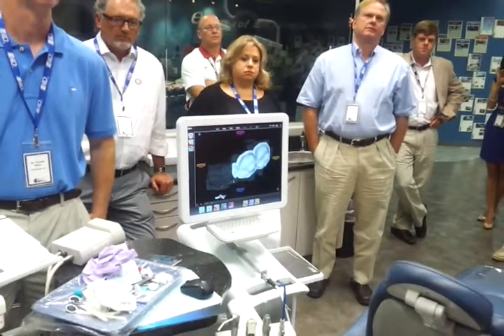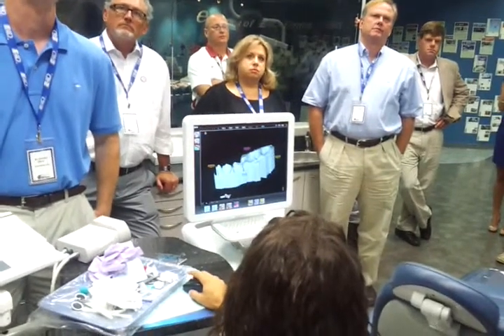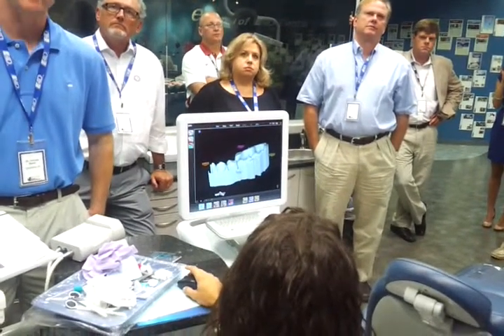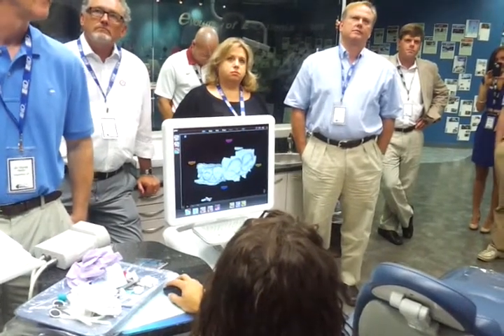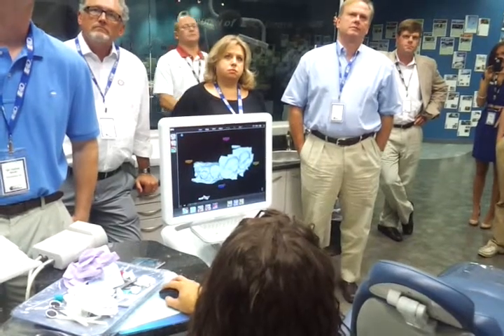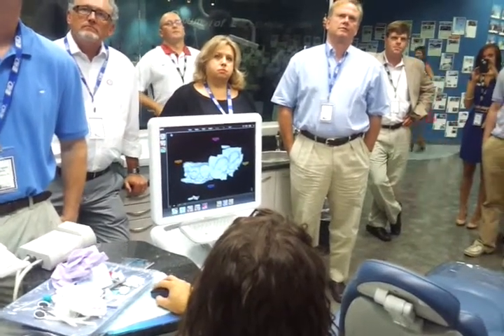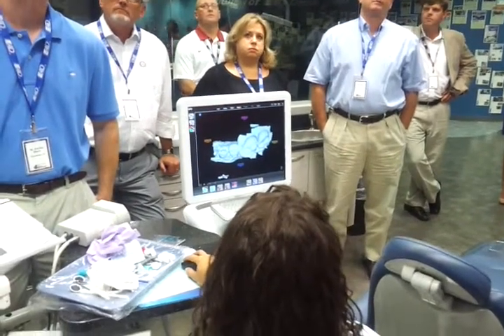On the occlusal, I don't need to know what's going on the buccal and the lingual. So I'm just capturing that occlusal data. That's why it looks draping right here, because I didn't care what that data was. What I'm going to do now is select my bite area. I'm telling the system that this right here is going to be his opposing dentition, so that it's going to take this into account when it's creating the occlusal surface of my restoration.